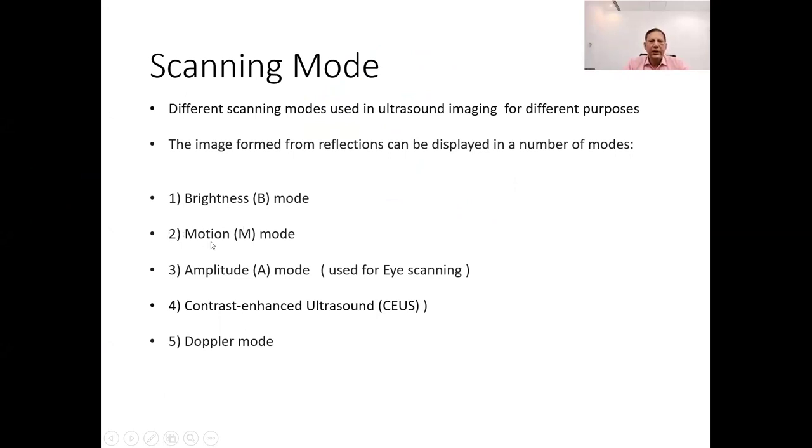1. Brightness, B mode. 2. Motion, M mode. 3. Amplitude, A mode, used for eye scanning. 4. Contrast enhanced ultrasound. 5. Doppler mode.